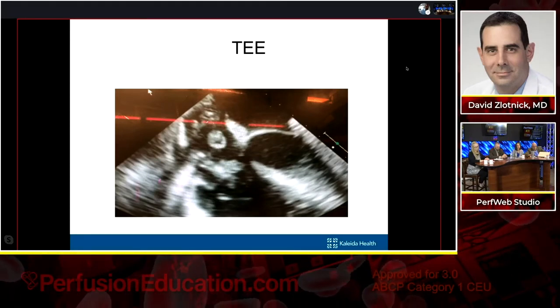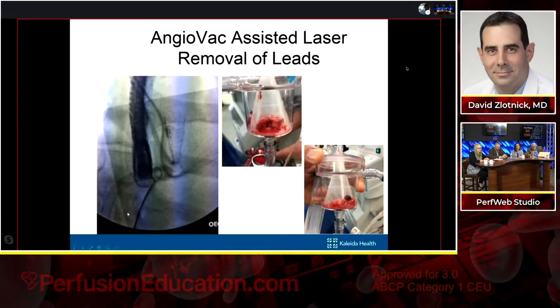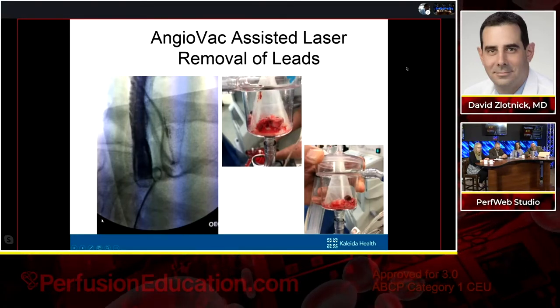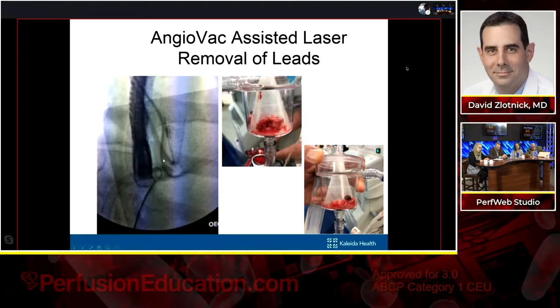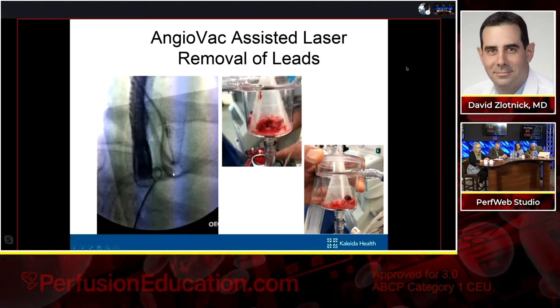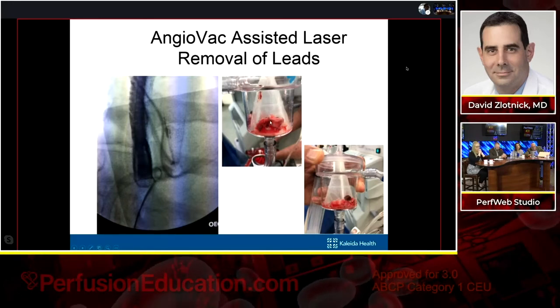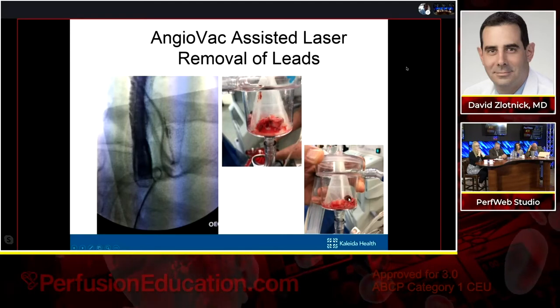And I'll walk you through the procedure. What we ended up doing was coming from below, so we did a venous-venous femoral approach. Came up from below using the snare, and that snare allowed us to torque the catheter to really get on the pacemaker leads and debulk not only the pacemaker leads, but also the right atrial wall. And this is the vegetation from the pacemaker lead, as well as that cystic structure that we were seeing on the right atrial free wall.